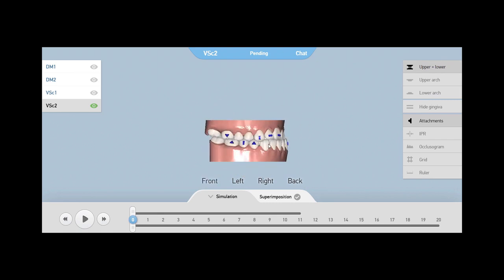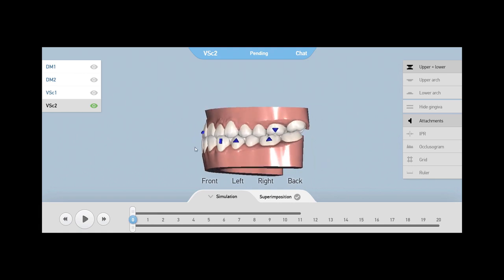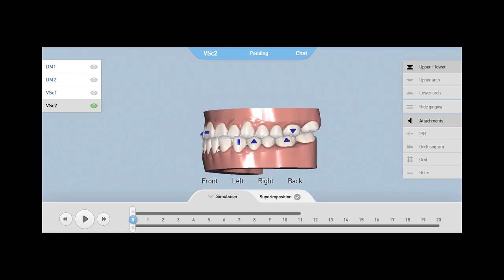This situation might seem rather difficult for aligners. At the same time, it was the case when a patient was ready only for aesthetic kind of treatment, that is, when the devices are not visible.